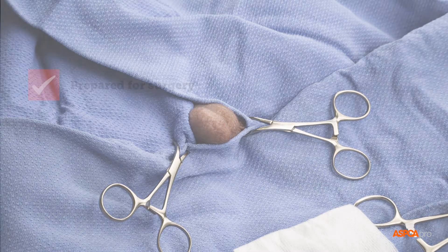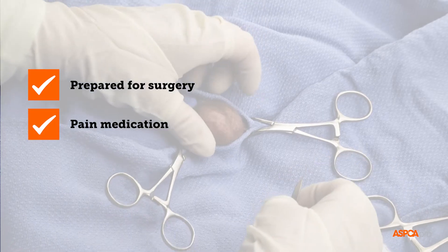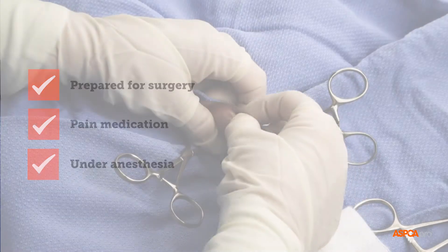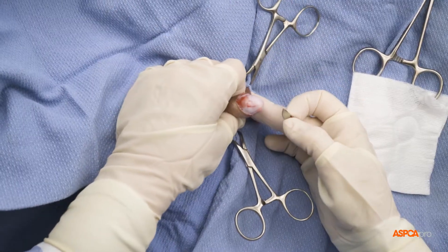Surgery begins once the patient has been prepared by veterinary support staff, been given pain medication, and is at an appropriate plane of anesthesia. First, a small incision is made in the scrotal skin over the testicles.